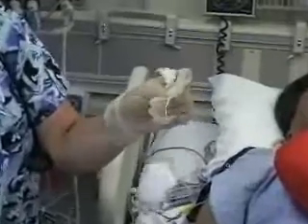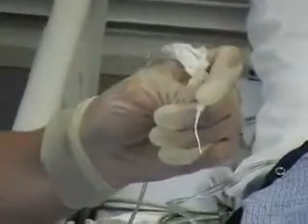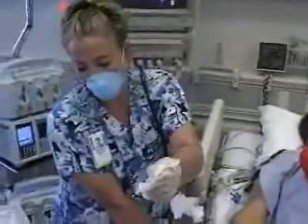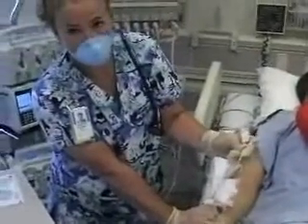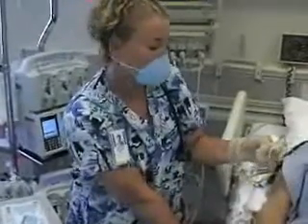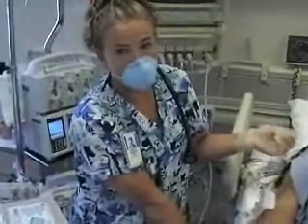If you need to do a tip culture because you suspect infection, you would need sterile scissors, and it's nice to have another nurse here. As soon as you take it out, as close to the patient as you can, the other nurse cuts the tip with sterile scissors and you close the cap. It's really hard to do a sterile tip culture by yourself; preferably it's done with another nurse.